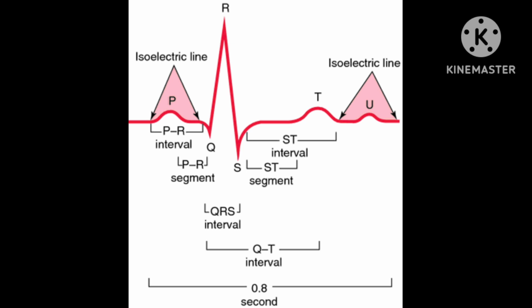For chemistry, they are using the word Kemistry, not like CHE. Then in that sense, sometimes they use the letter K, and at that time it is called EKG also. ECG is also called EKG. Here K means the letter K is used instead of CH or C. Here we say ECG, there they will say EKG, but they are the same thing.